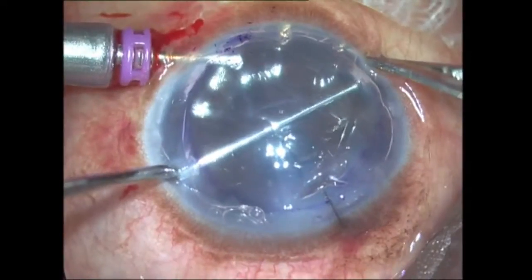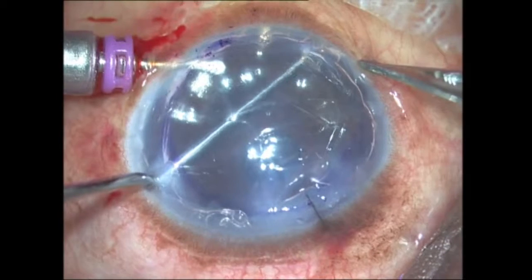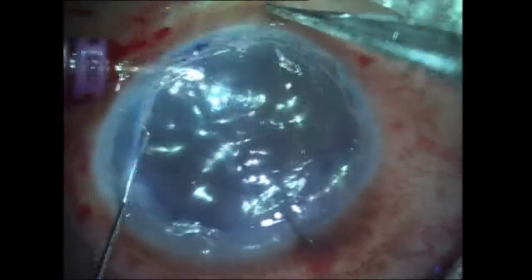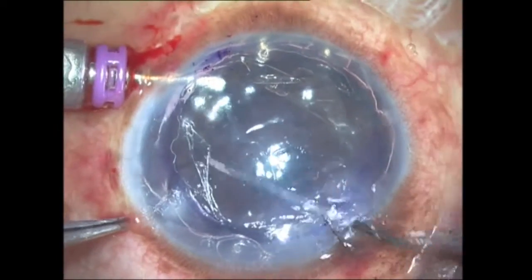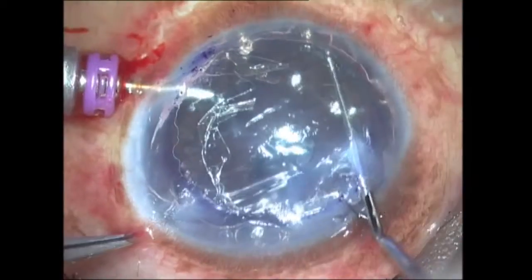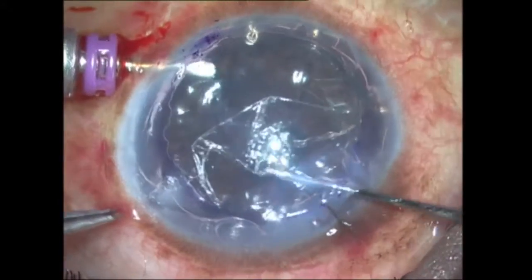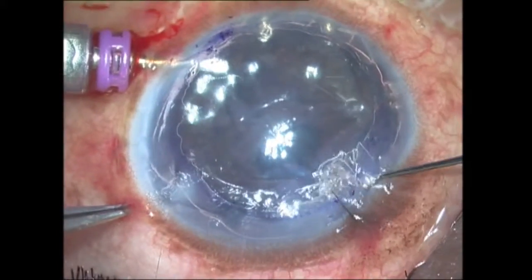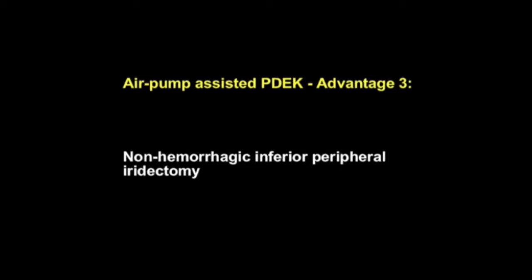What you can see I'm doing now is I've marked the cornea, and the second advantage of the air pump assisted PDEC technique is that you do your descemetorhexis under air. The reason I call it air pump assisted PDEC is very simple: it's just an air pump continuously pushing air into the anterior chamber. What that does is it lets you do a descemetorhexis just like you would do a capsulorhexis. It keeps the Descemet's against the cornea, gives you clear, visible margins of the descemetorhexis, and much like a capsulorhexis you can tear it around easily. It doesn't flap around in the anterior chamber as it would otherwise.